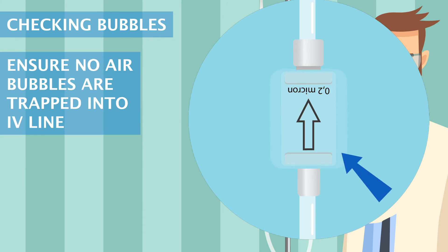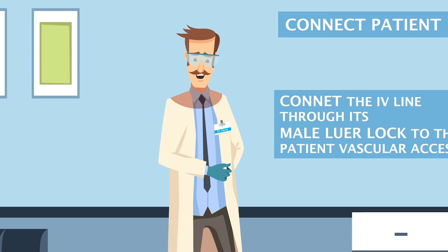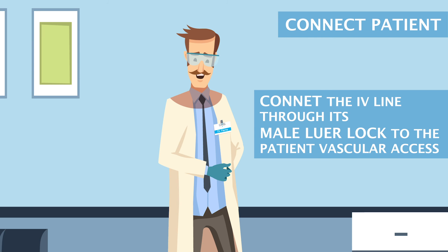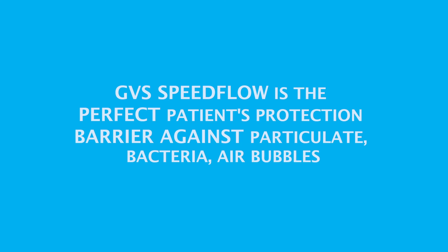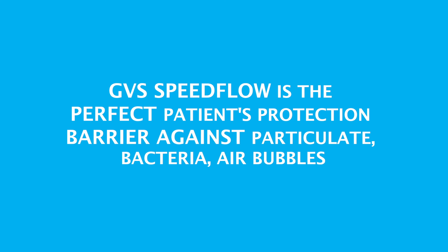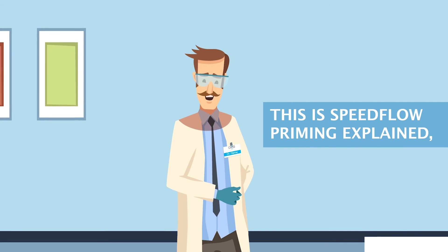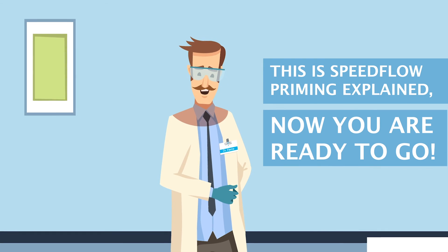Checking bubbles: ensure no air bubbles are trapped in the IV line. Close the roller clamp. Connect the IV line through its male luer lock to the patient vascular access. GVS Speedflow is the perfect patient protection barrier against particulate, bacteria, and air bubbles. This is Speedflow priming explained. Now you are ready to go.